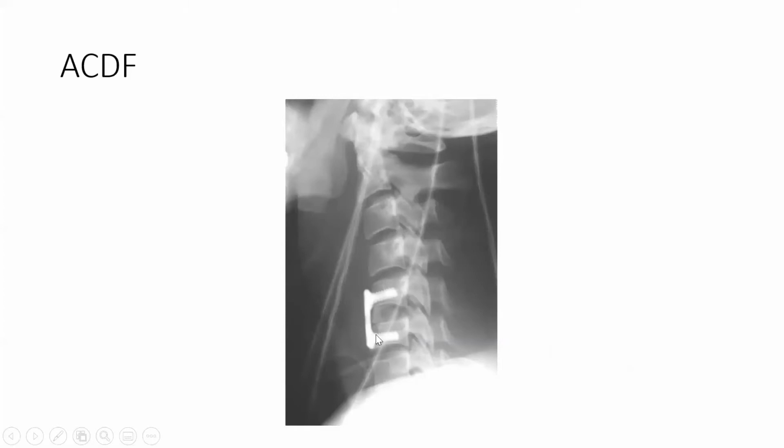But if you've got degeneration, like a patient with a degenerative neck and disc prolapse, you don't have to put a plate on. Okay? You can take the disc out and decompress the canal or the nerve and just put a small little bone graft in here. But these bone grafts tend to collapse. So it depends how you harvest them.